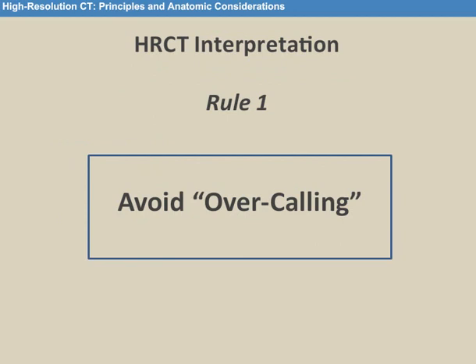What do I mean? Well, sometimes the HRCT is absolutely normal. And we're not saying the lungs are normal. All we're saying is that the HRCT examination is normal. And that's a crucial point to understand for us as radiologists and also for the clinicians that we report to. Because what we're saying is the HRCT is not picking anything up, and I'm not going to be able to pick anything up regardless of whatever history you give me.